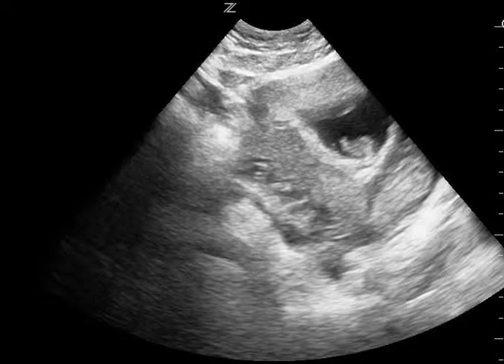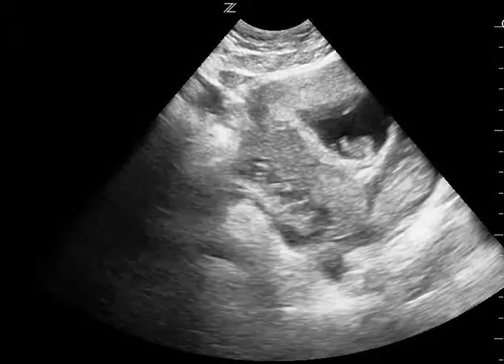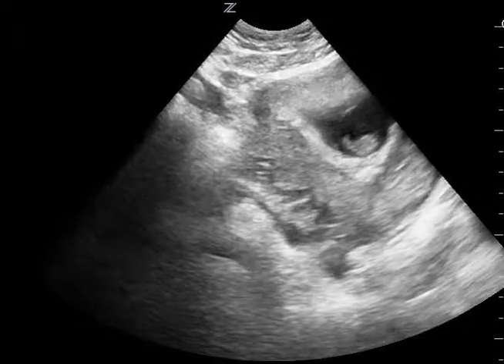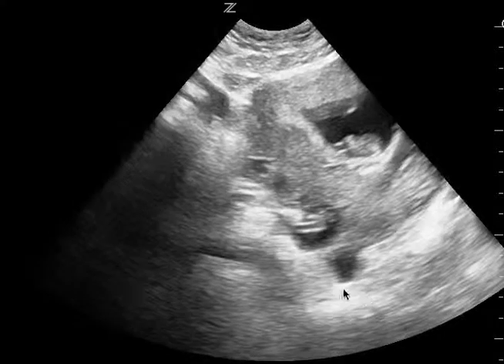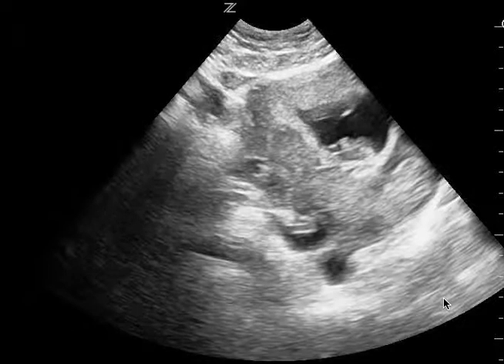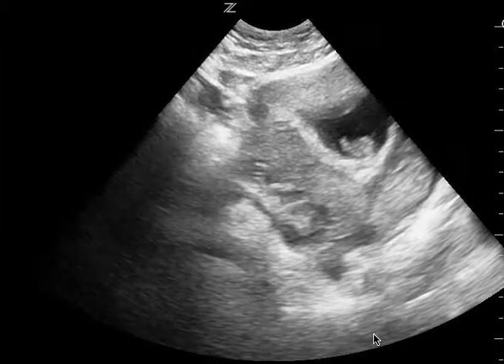A couple of takeaway points: try to fan or move the probe so I can see the various areas around the uterus to see how extensive the free fluid is. Decrease the gain — this is too bright. And again, if you do see something like this concerning for free fluid, most likely it is probably physiologic, but you do need to consider pathology if this is in the setting of trauma.